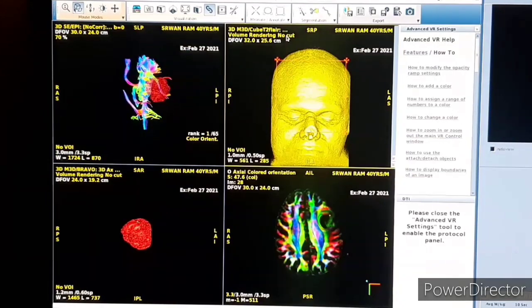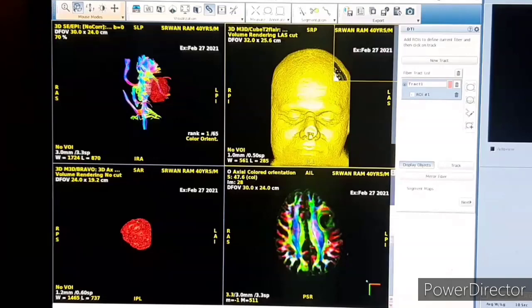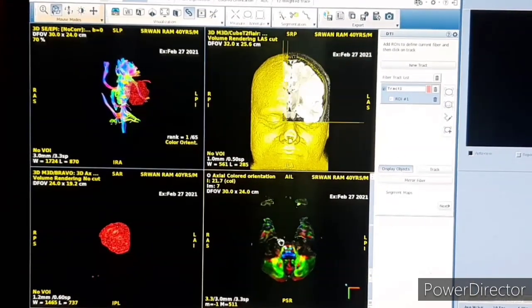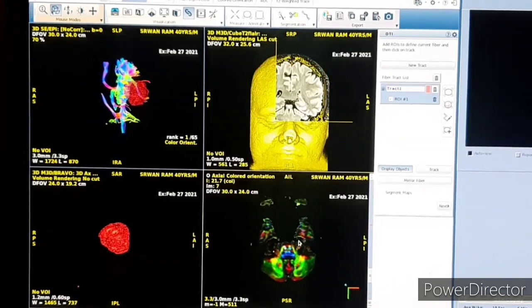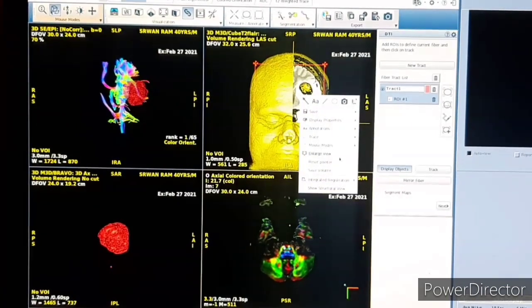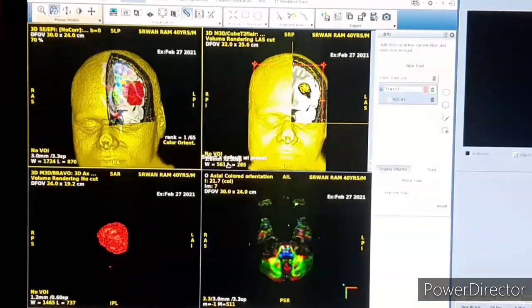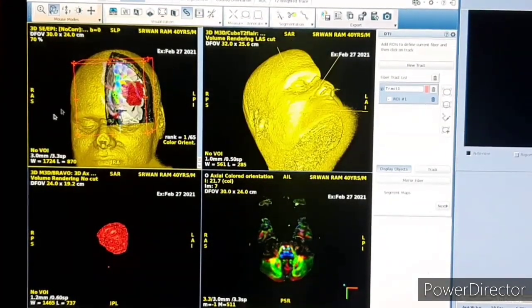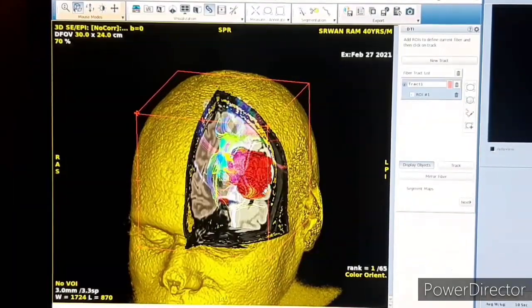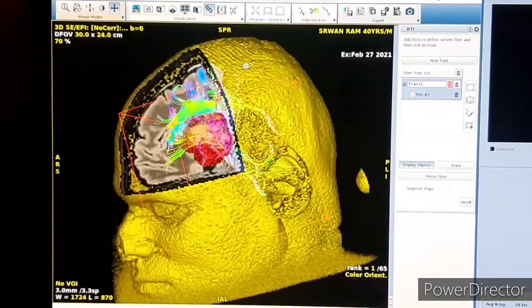Now we will go to the Show Cuts option — you can choose which side you want to cut: the tumor side or another. You can select in the No Cuts option. Just adjust where the tumor is, and using the same mouse and selection option, drag the upper blocks of the 3D. You can see it's a very nice 3D view.